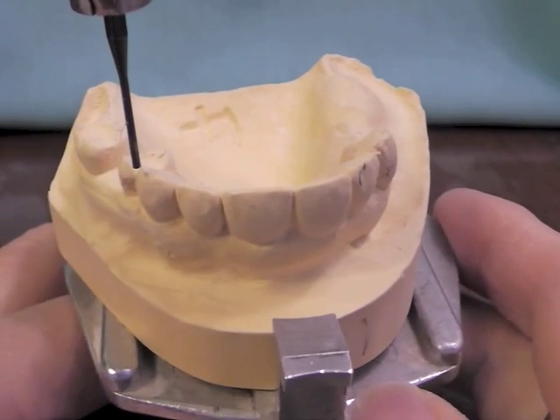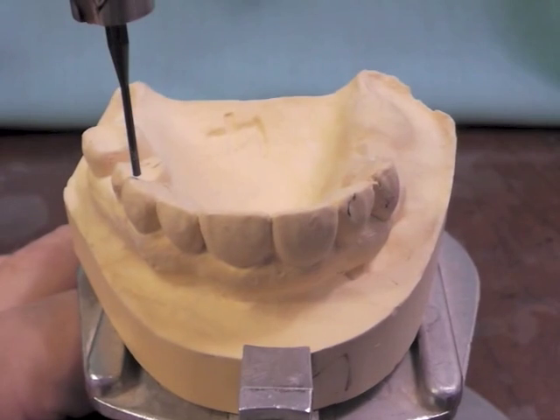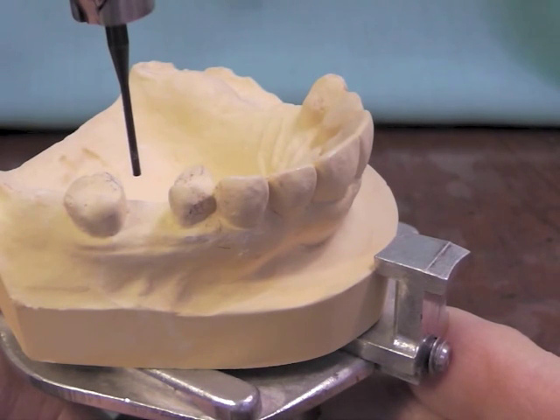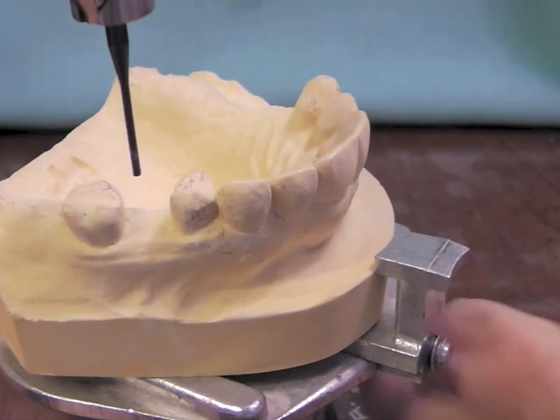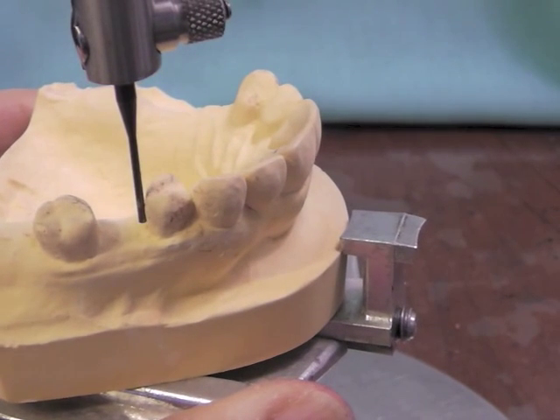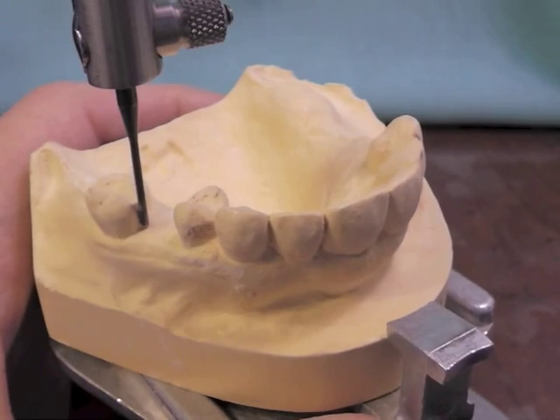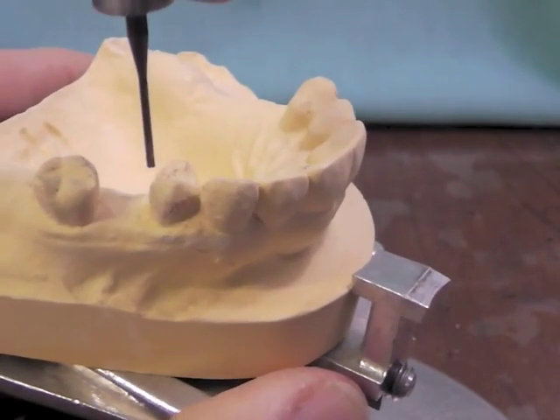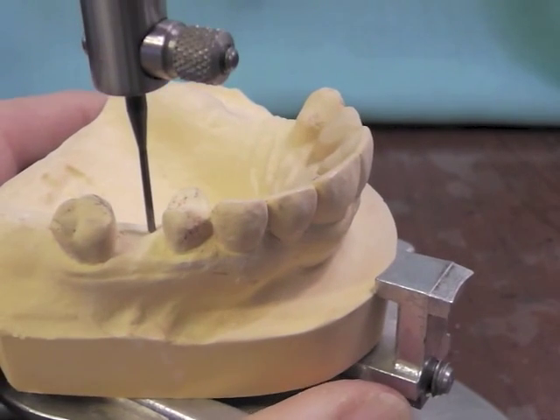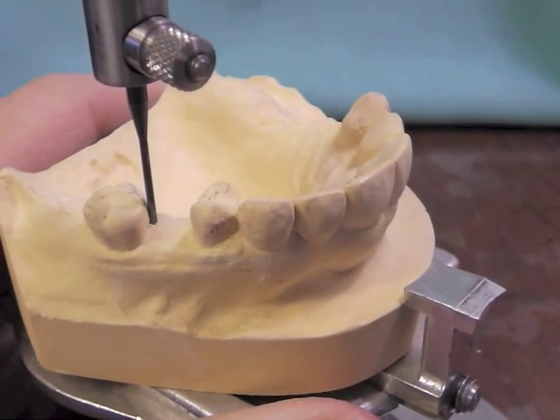I have begun by roughly paralleling my occlusal plane to the floor or to the platform, and I've tried to line up equal guide planes on the tooth-supported side. I'm going to first look at my guiding planes — I have a low survey line on that particular tooth, and really a relatively low survey line on that particular tooth. Had it been that this tooth was leaning more in this direction, I would have tilted my cast posteriorly, but I would like to end up with equal guide planes on both the molar and the premolar.